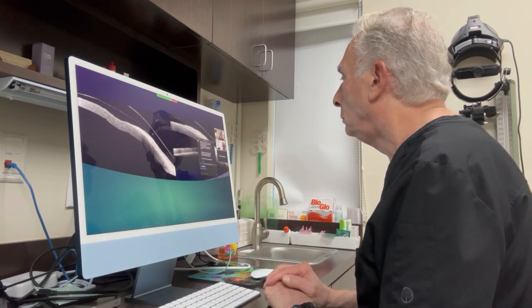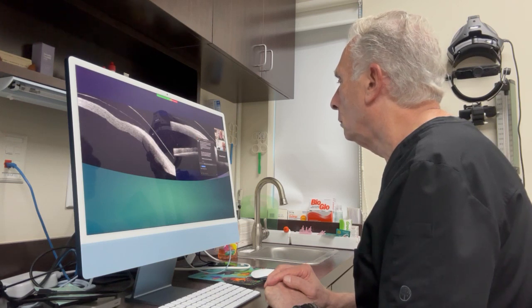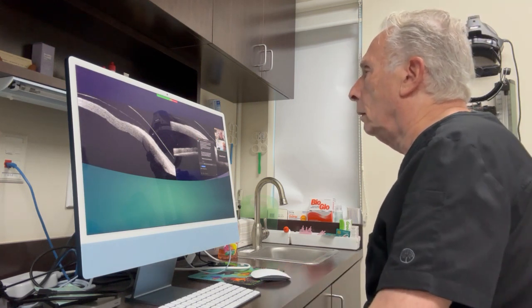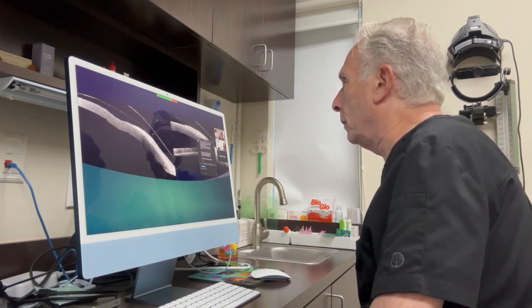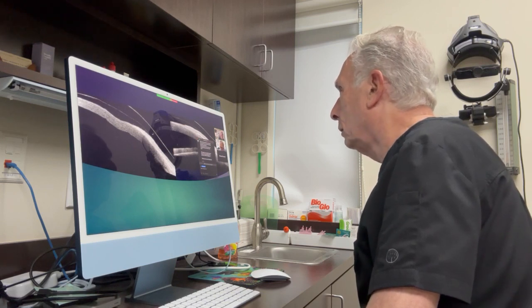For ocular surface complications such as ocular surface disease, dry eye, and so on, how much clearance do you advise people to do with a 7.4? I would try to be after the lens settles down. That's as important, because sometimes these lenses can drop 100 microns. So after the lens settles down, I would want at least 200 microns of clearance.